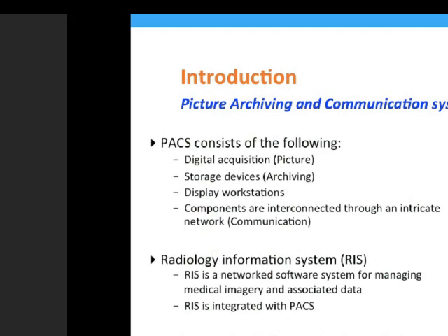Okay, and that is pretty standardized, which is used for this entire communication and processing domain of medical images. So this is a sort of workflow which happens in a hospital.